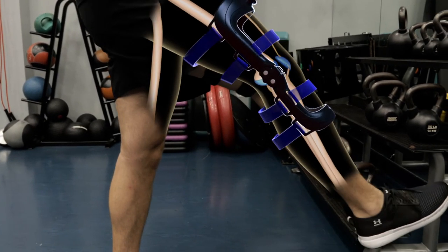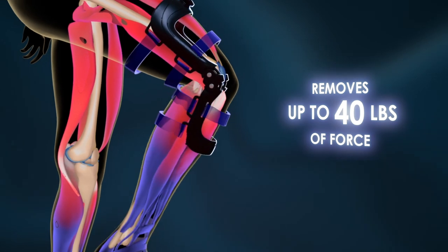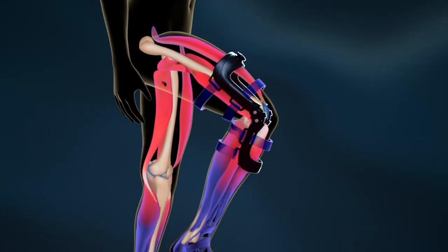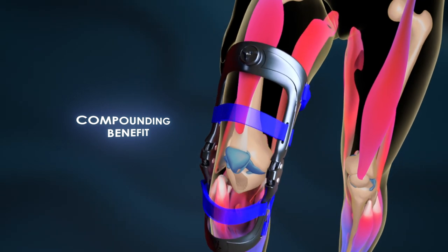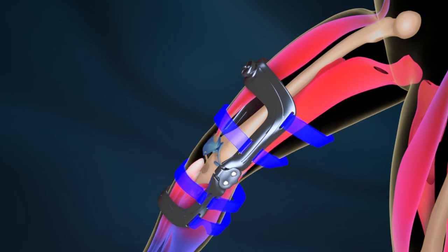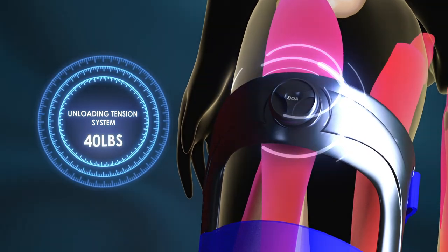The Ascender knee brace is designed to alleviate the symptoms of osteoarthritis. It works like an external muscle-tendon system to remove up to 40 pounds of force off the knee during flexion, delivering instant relief and making once-painful activities feel natural again. Since the knee is a fulcrum joint, any weight unloaded has a compounding benefit for pain reduction. The unloading tension system of the Ascender Brace holds the power to make your knee feel strong again.